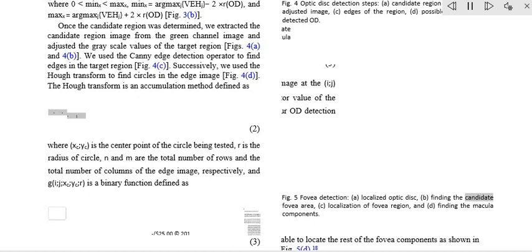6. Where |·| denotes the absolute value of a real number, rho is the length of the vector from the origin to point (x, y), theta is the angle from the x-axis to the vector, and A_nm* equals A_n,-m. Here, V_nm*(rho, theta) are the Zernike polynomials and are denoted as in the following formula. 7. We used the first 15 Zernike polynomials to assess the global quality of retinal images in this work because they provide higher accuracy rates for shape-based classification tasks.